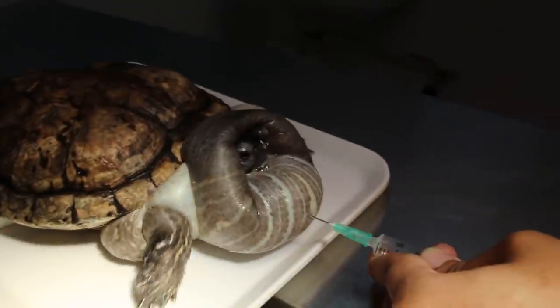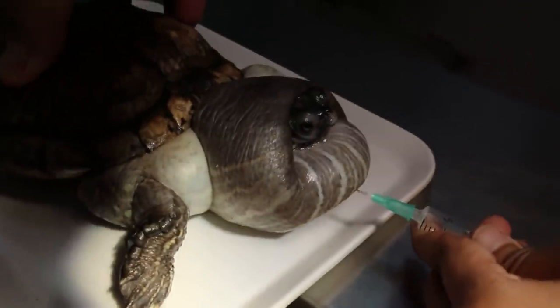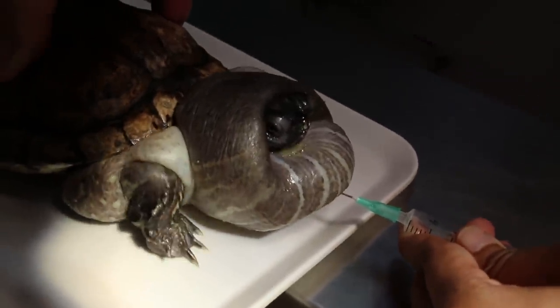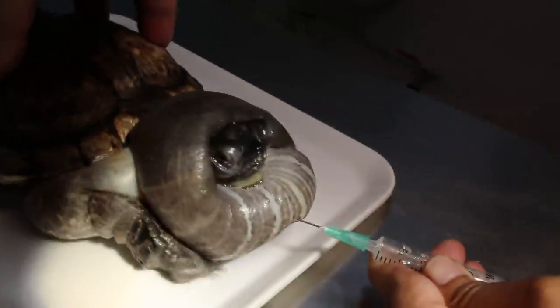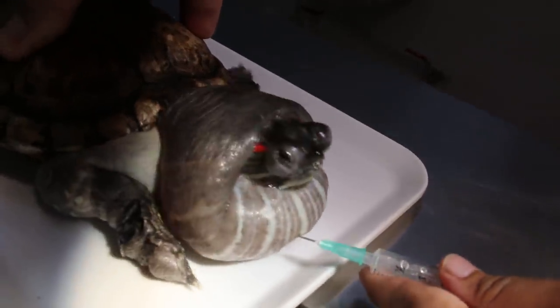So once we aspirate the fluid, it will feel better. A bit is coming out now. It's more to the ventral side.